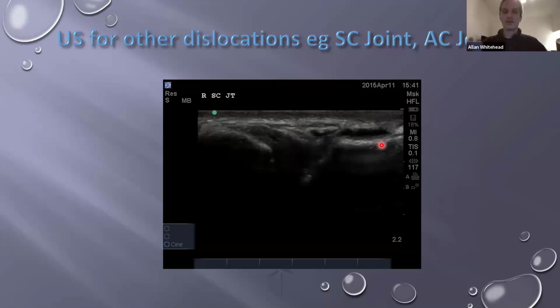So I would be coming in a transverse plane, if you can see me. Actually, I've got it on screen sharing. I'm not sure. I think you can see my face at the same time, or my body at the same time.